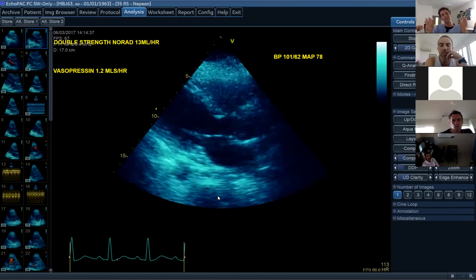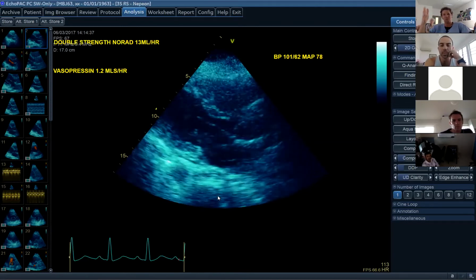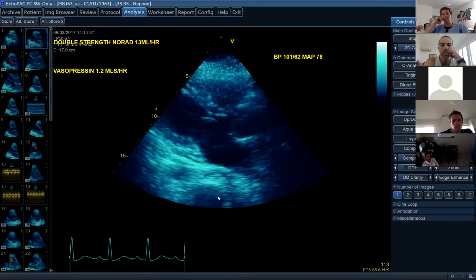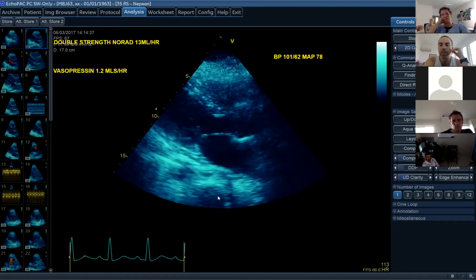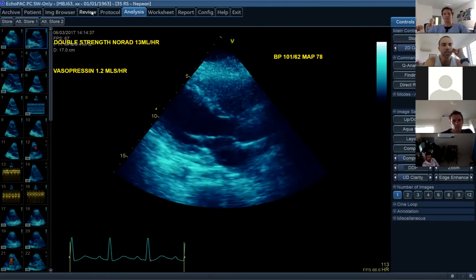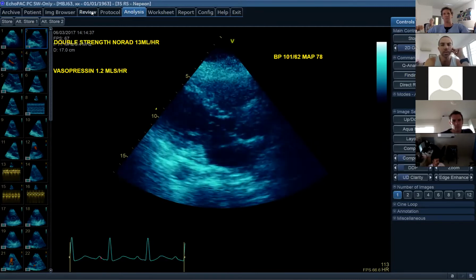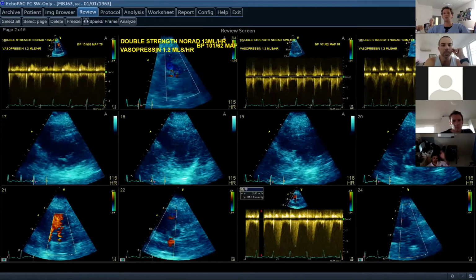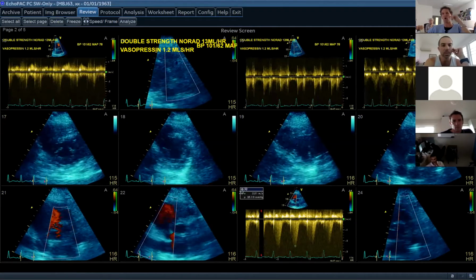But what's tricky to examine in these patients is that you don't know if this is acute or chronic. Yeah. Probably an acute component to it if she's this sick on all this support, but we don't know. So the only way that you can see if this is septic cardiomyopathy is to support her and then do a repeat echo and see if it's improved. Give it some time. Yeah, you got it. That's why I find it really tricky to do studies or read studies about them, because it's quite hard to define exactly what a septic cardiomyopathy is sometimes. But that's fantastic. That's the whole case, really: if you're on a truckload of support and the heart looks like that, there's something wrong.